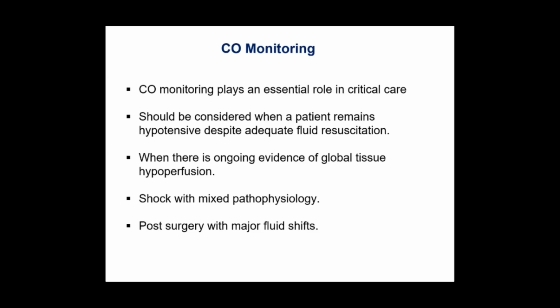We will not just think about giving fluid or optimizing therapy based on the blood pressure alone or the heart rate alone. We need more information. In cases of post-surgery with major fluid shifts, like cardiac surgery, major vascular surgeries, transplant surgeries, these are the situations where you need cardiac output monitoring.